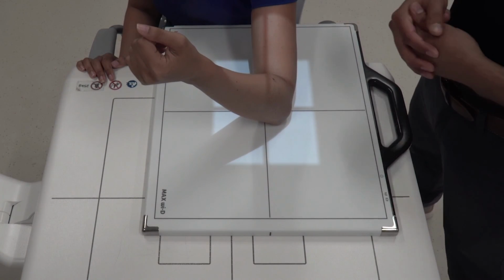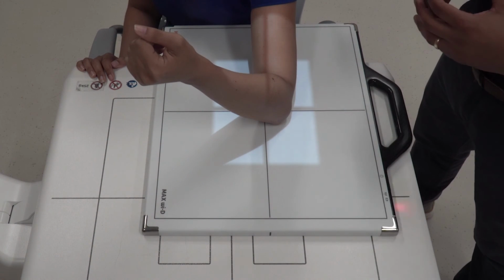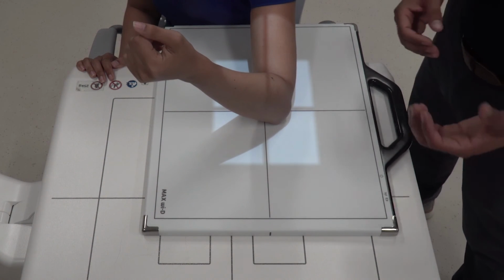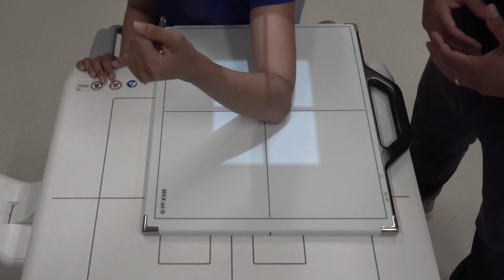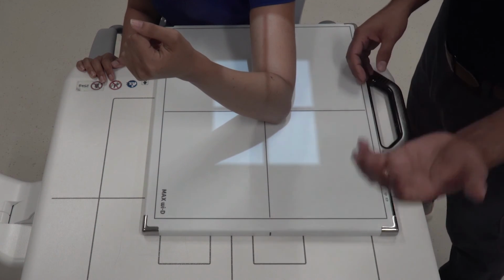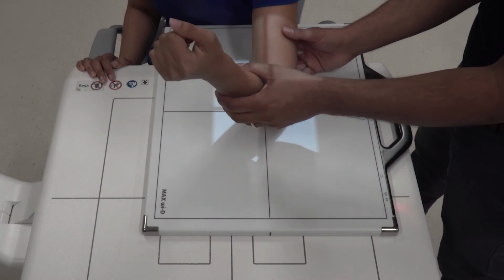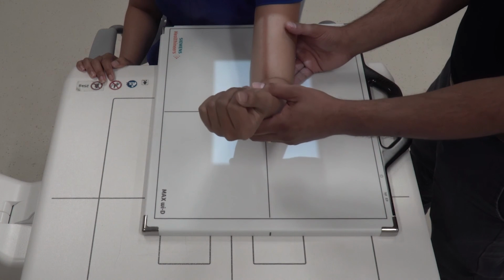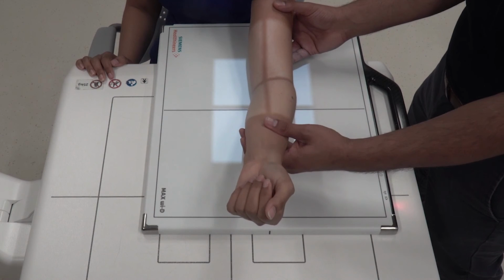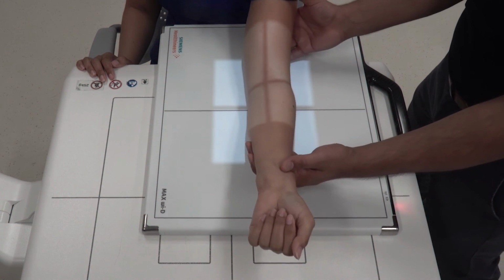Positioning for an AP elbow. When a patient comes in from an elbow injury, a lot of times they're guarded and will only give you so much movement. It's important to get that elbow fully extended, and there's a few ways to do that. One is to just explain to the patient the importance of extending the elbow as much as possible. Second is assisting the patient in getting that elbow extended while fighting the resistance. And the third is just using distraction techniques like asking if there's any pain here or any pain here while extending the elbow.